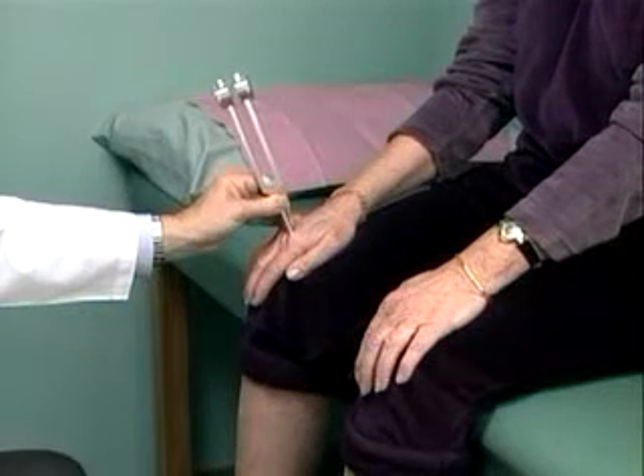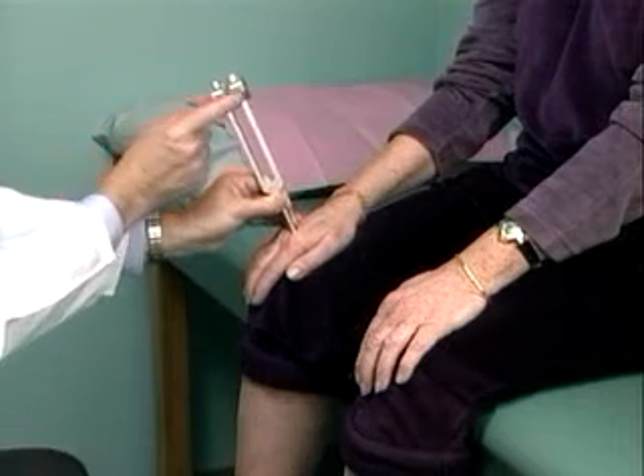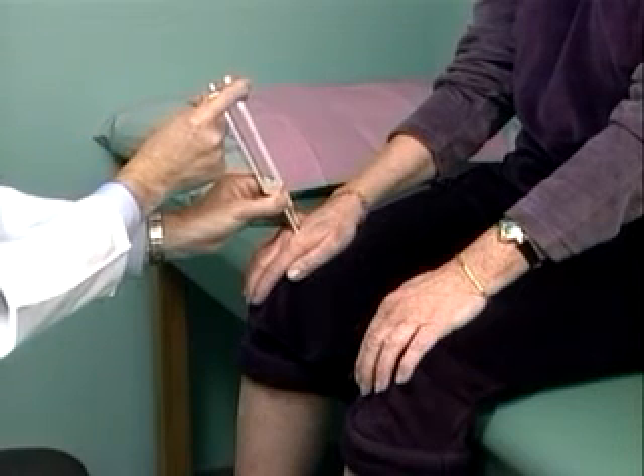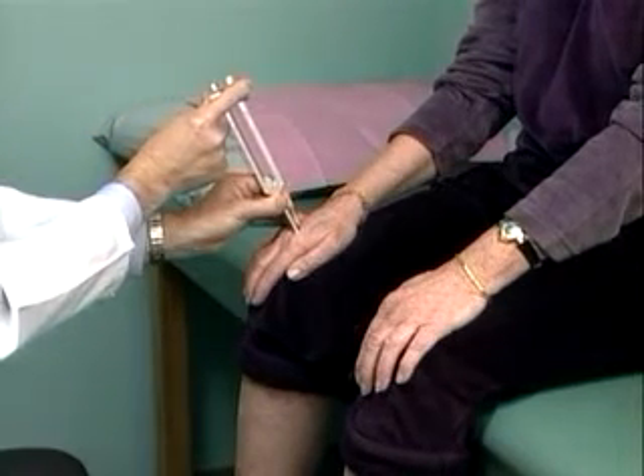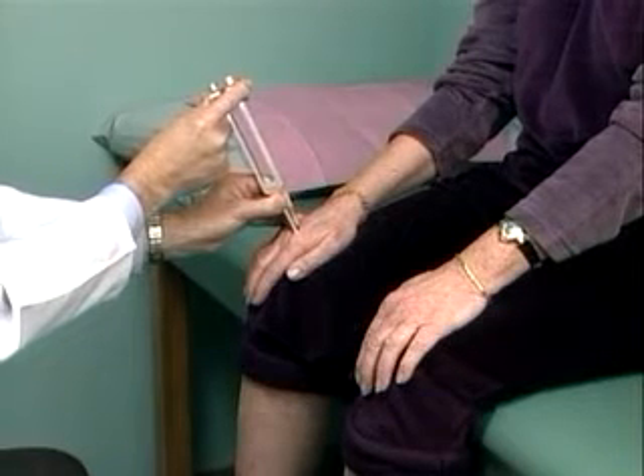The test for vibration sensation is first done on the patient's hand to ensure that they understand the feeling they are being asked to identify. With the patient's eyes closed, they are asked to signal when the vibration stops.